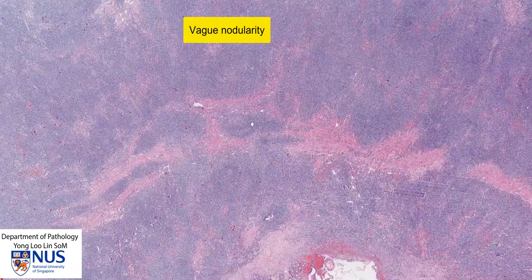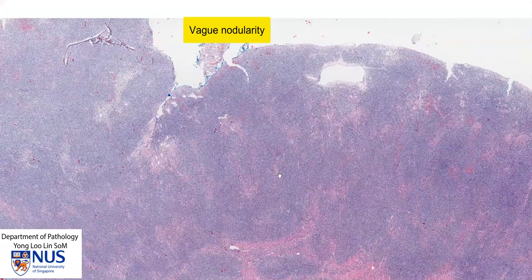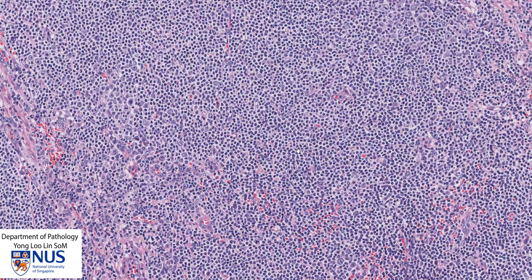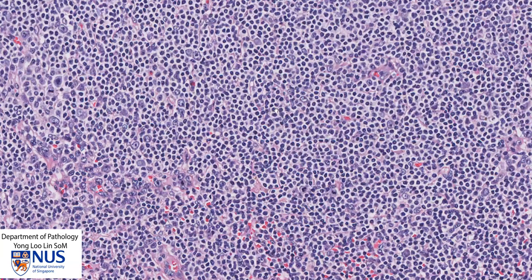Taking a closer look at the infiltrate, in many areas it appears very diffuse and formless. However, there is a vague nodularity in some areas if you look very carefully. The reason why lymphomas tend to appear blue on low magnification is because lymphocytes have very high nuclear-to-cytoplasmic ratios, meaning most of the cell is composed of the nucleus, which is blue in our H&E stain, and hence lymphomas tend to appear blue on low magnification.